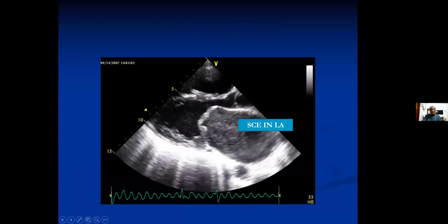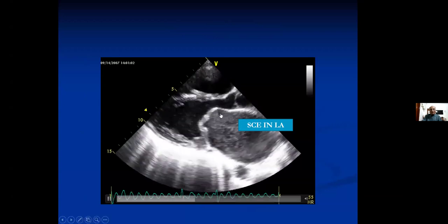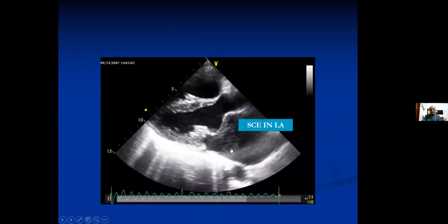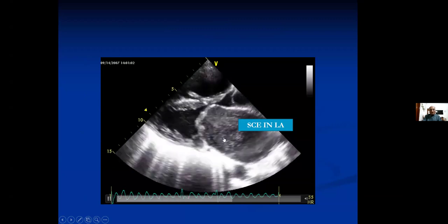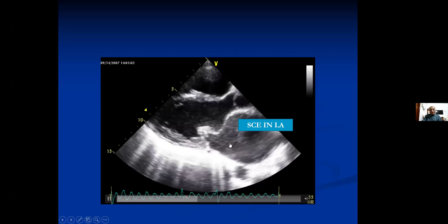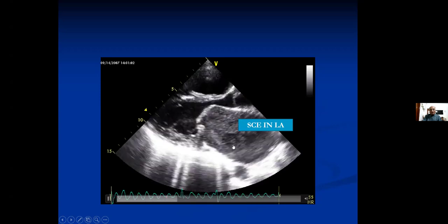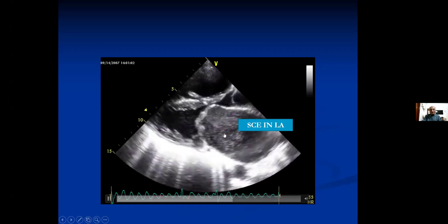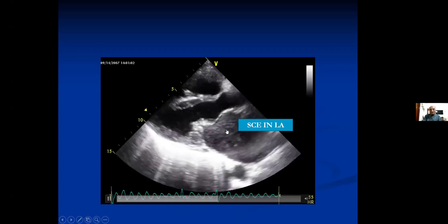Complications, of course, just interesting images so that you can see this. In mitral stenosis, there is a marked smoke, what is known as a spontaneous contrast echo. This is usually found in association with atrial fibrillation, when the blood components are moving very, very slowly in these cases, and when the ultrasound beams strike against them, they produce this sort of a mass. They are a precursor for a thrombus.